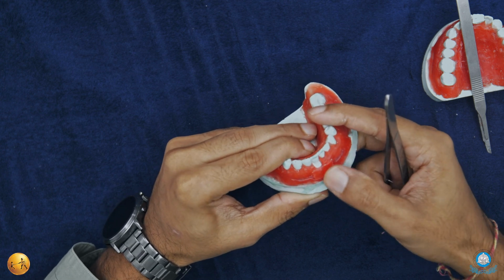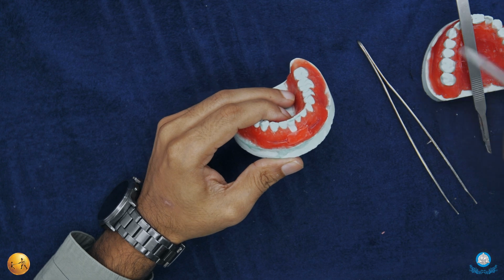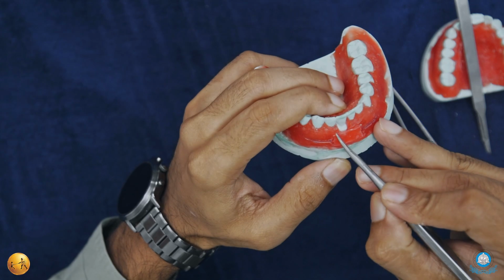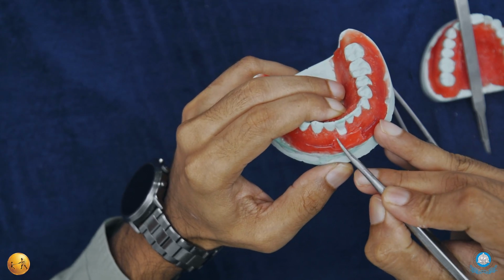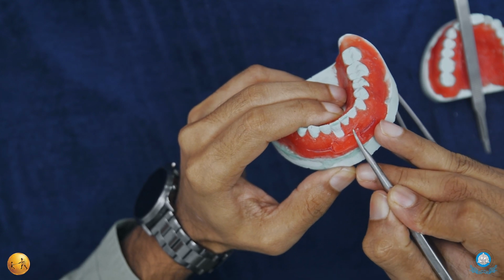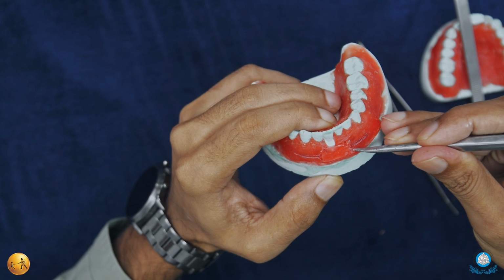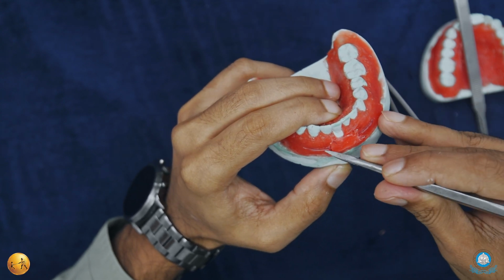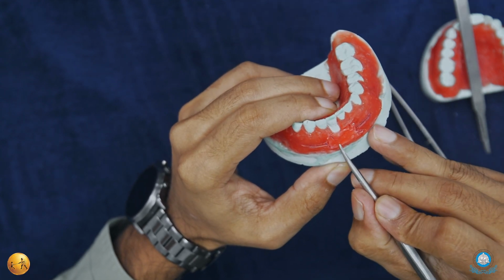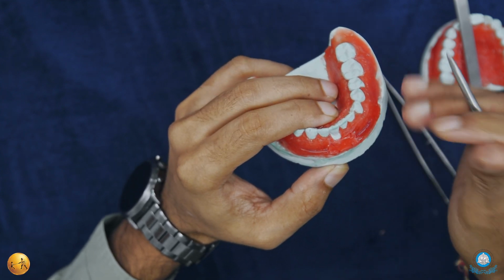Once it is firmly adapted, you can start suturing the graft. The sutures are given in the coronal area of the graft on either sides of the recession defect, one each at the lateral ends, and if required you can give periosteal sutures also to stabilize the graft.